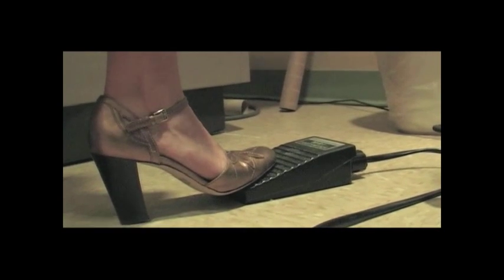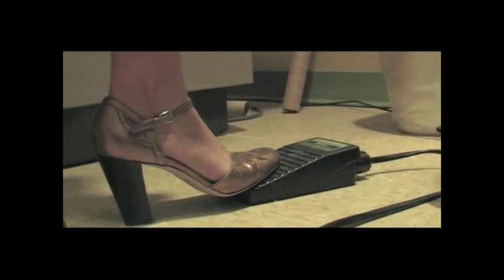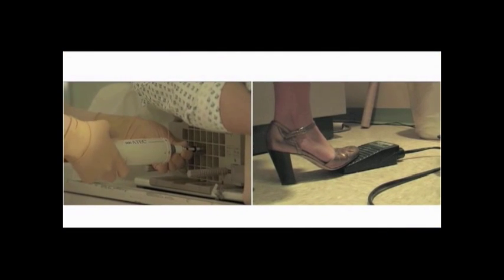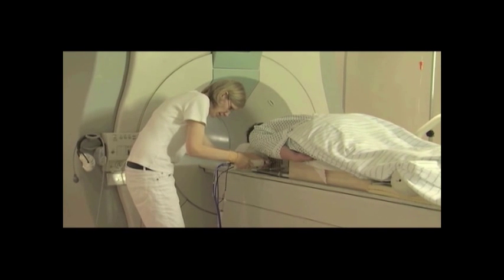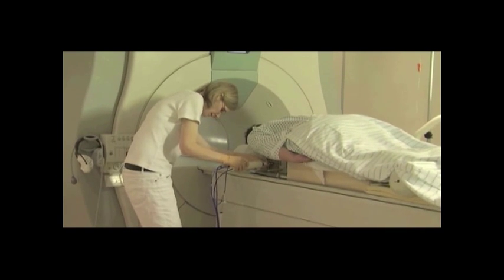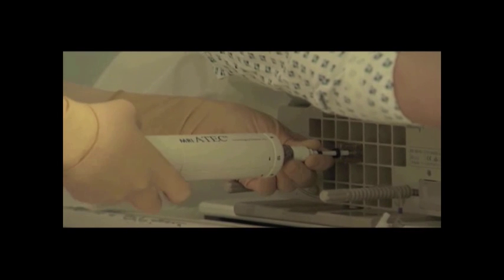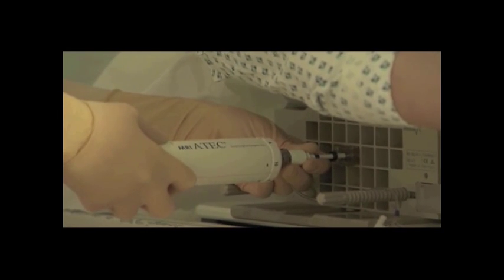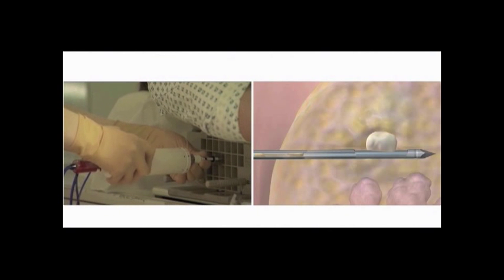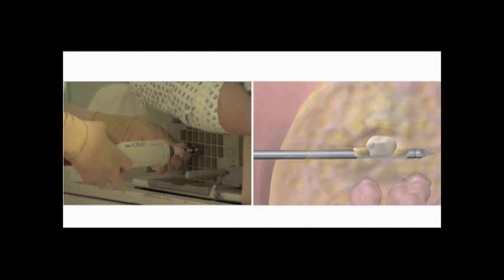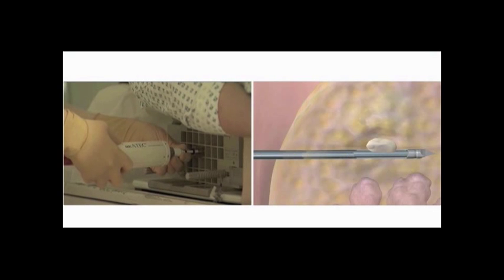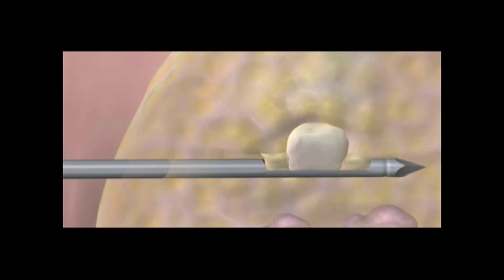Depress the foot switch to activate the biopsy system and continue to hold the foot switch down throughout the tissue acquisition sequence. Tissue acquisition occurs every 4.5 seconds. A beep indicates the end of one cutting cycle. Manual rotation of the handpiece occurs just after the beep during the resting phase of the biopsy cycle. The Atec handpiece acquires tissue samples until the foot switch is released when all necessary core samples have been retrieved.